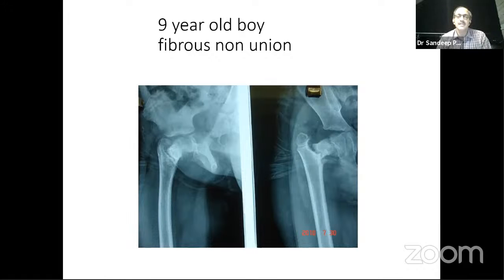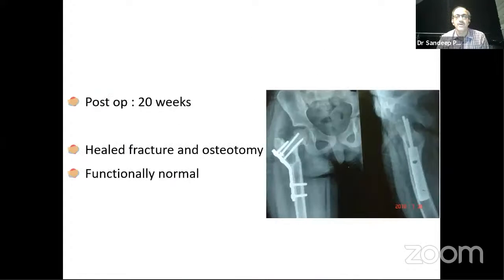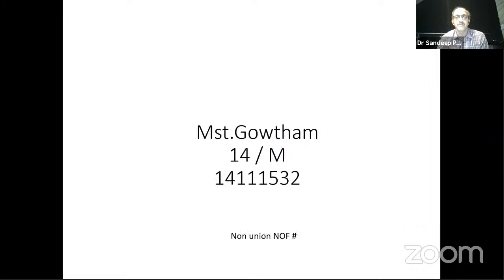So here again, since this is in relatively decent position, in situ stabilization, a subtrochanteric osteotomy. These were the younger children. I just used a pre-bent DCP, the humerus medium-sized DCP, and that went on to a satisfactory union without avascular necrosis. So the principle is, in delayed unions, we are not really trying to go in, open the capsule, do an anatomic reduction, and compromise the vascularity any further. So this is his long-term follow-up, and he did pretty well.